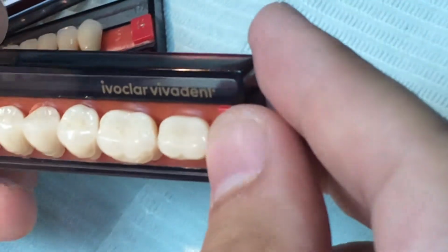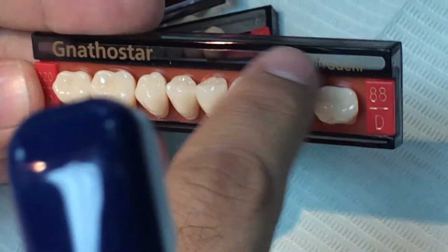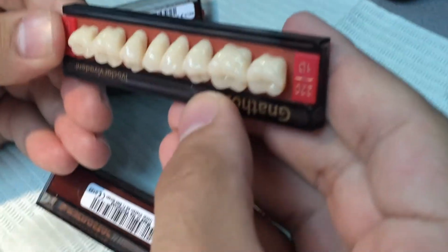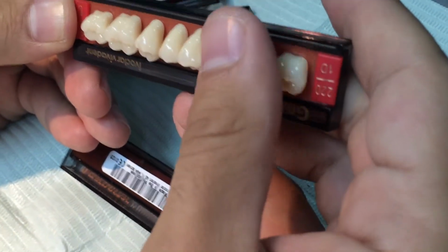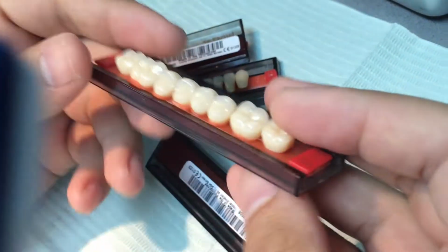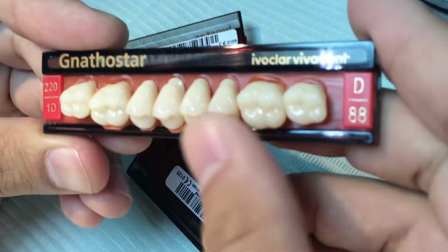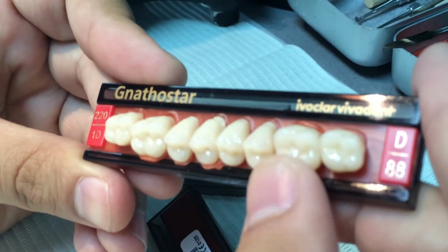If you can read them, you will see these teeth come from down to up, which means it's the posterior lower teeth. If it's like this, you cannot read what's written there, so this is the wrong way. You have to put it like this, and then you will know this is the lower teeth. Also for the upper, like this. Yes, I can read them. So these teeth come from up, and these are the upper teeth.